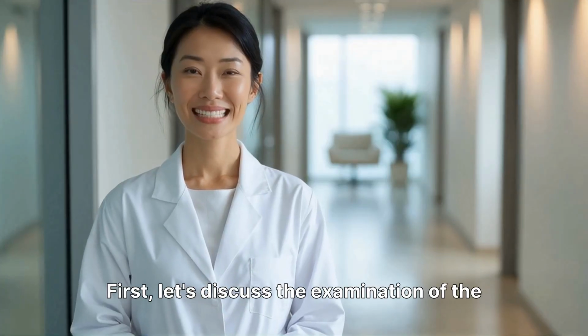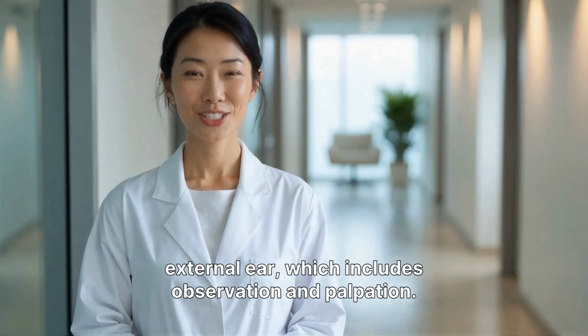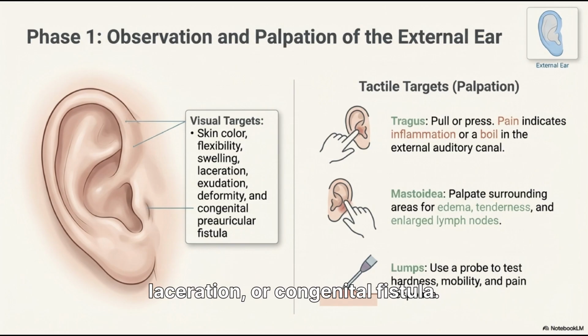First, let's discuss the examination of the external ear, which includes observation and palpation. The examination is to observe the skin color, flexibility, and mobility, checking for swelling, laceration, or congenital fistula. Palpation finds tenderness or lumps. A probe can test lump hardness, while pulling the tragus identifies inflammation.